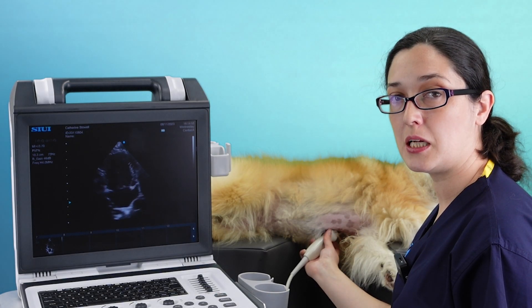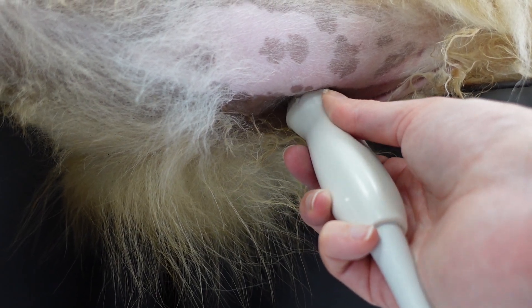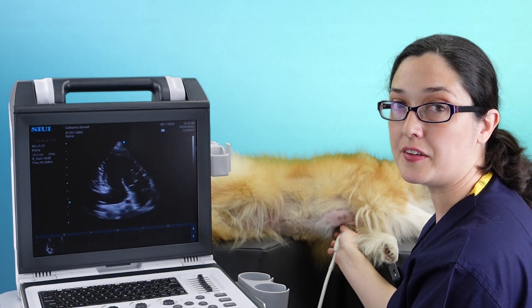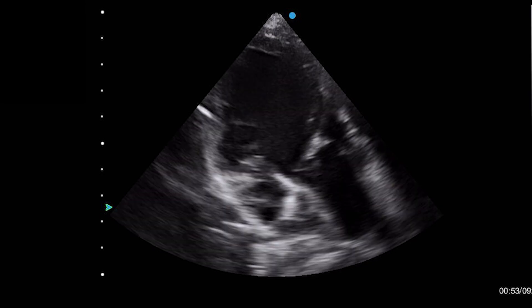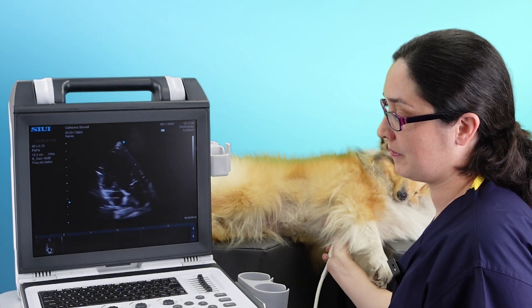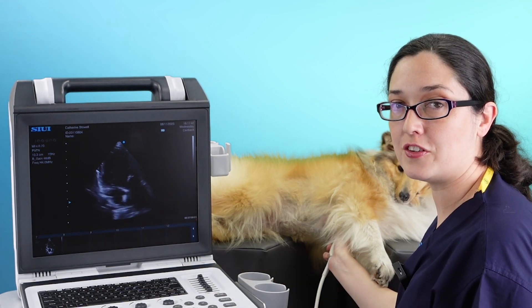Now to get to my three chamber view, I'm just going to carry on in that same direction, so just twisting a little bit more. With dogs, you may have to just lift the tail of the probe ever so slightly. With cats, it should just pop into view by default. The reason this is called the three chamber view — it's not really three chambers, but we count the aorta as a chamber. So you have left ventricle, left atrium, and your aorta. You should clearly be able to see the aortic and mitral valves in this image.